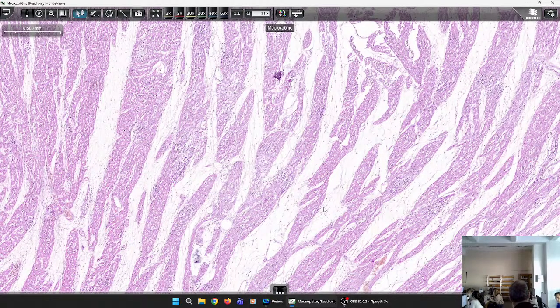It will not stain at all. So it is not fibrosis. And what other sign of inflammation may be related to this increase in the distance of the damaged myocardial cells? Remember the signs of inflammation and you'll find it. No? What can this be?